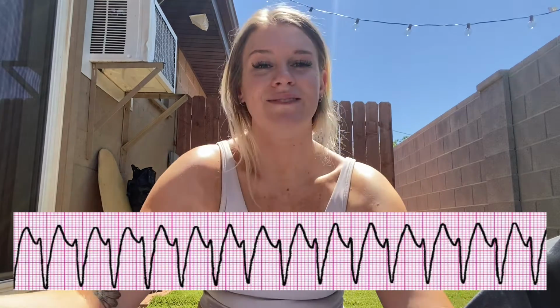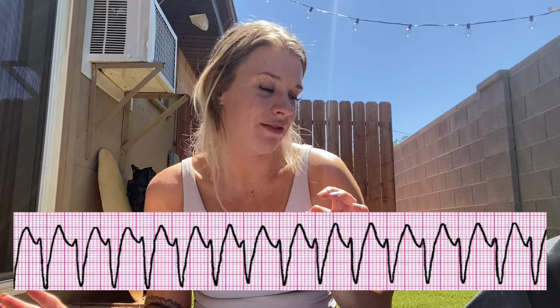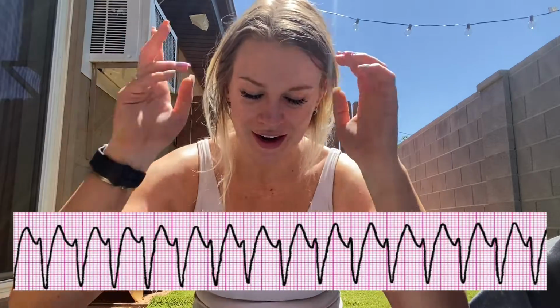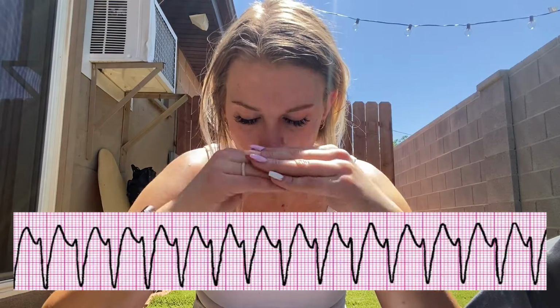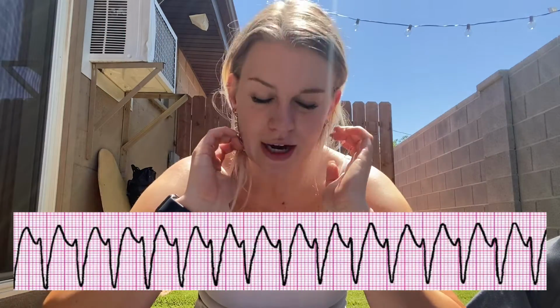Now let's talk about V-Tac, the big V-Tac, ventricular tachycardia. This is going to be nothing but premature ventricular contractions, and it's an ectopic rhythm. So one of the little ectopic cells in the ventricles is like, guys, I'm taking over, I'm the boss now, there's no sinus node, it's all me. It's going to be only wide, bizarre, and fast QRSs, like bum, bum, bum, bum, bum, super weird and funky. The rate is going to be about 150, so a little bit lower than SVT.